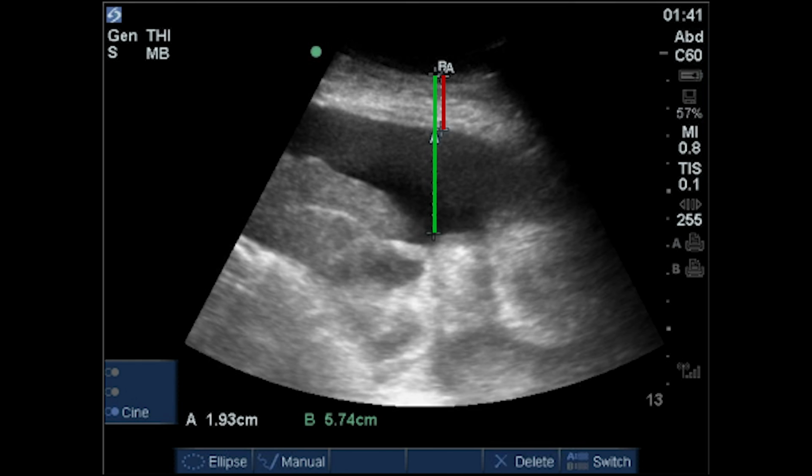In this example, the clinician can now begin the procedure knowing to expect to insert the needle at least 2 centimeters before entering the peritoneum, and knowing that if he or she is approaching 5 centimeters, they should probably stop so as to avoid injuring the underlying organs.